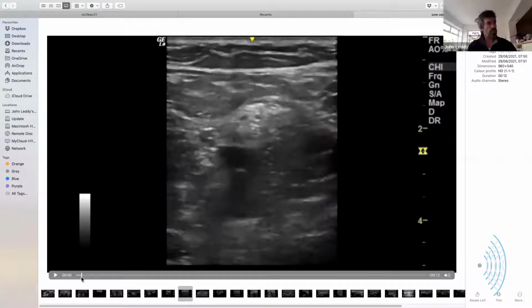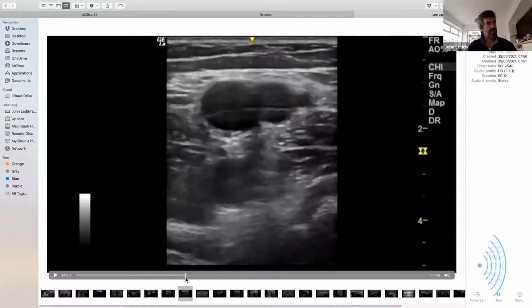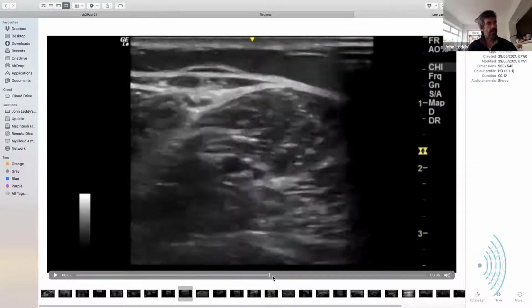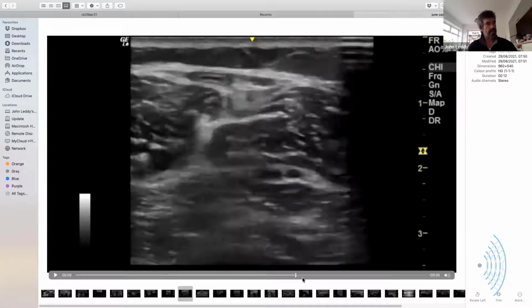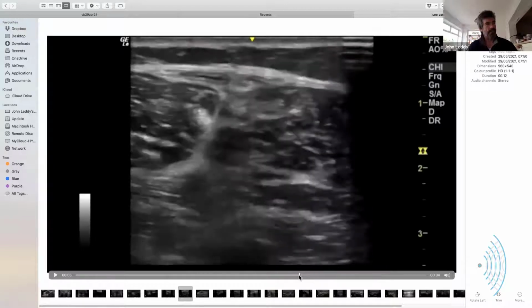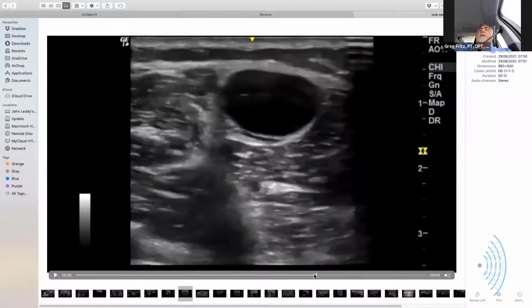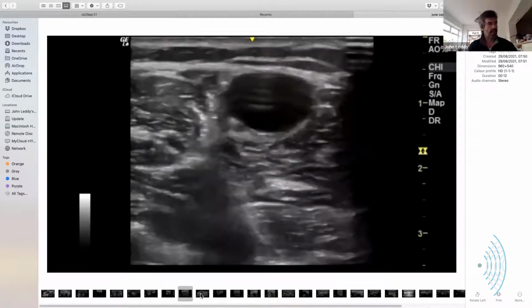So you've got your sural nerve there, and this ganglion sitting there is pressing on it. Here, you can see the nerve nestling in the gap. Yes. The vein is there, not being shown very well, but the ganglion is going to come into view there. Yes. We've only got a short clip there. That nerve being pressed there.